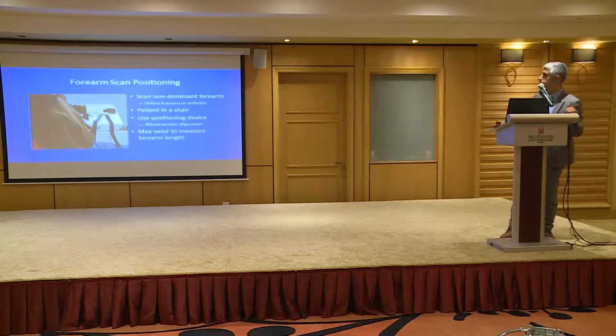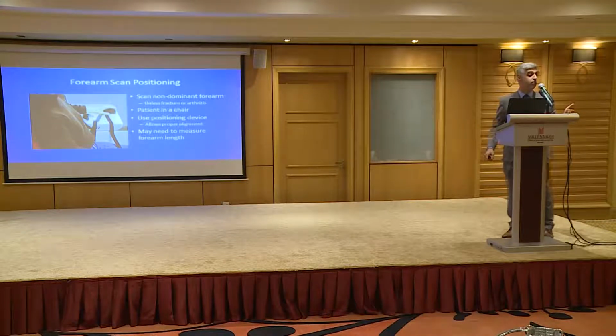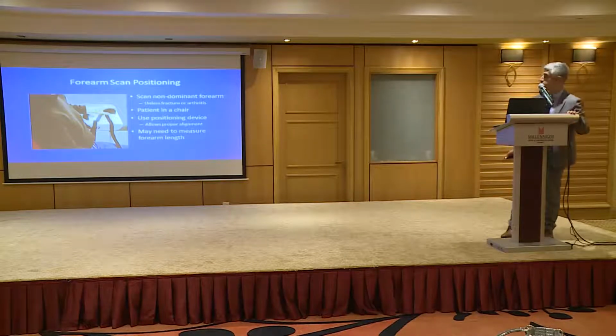The forearm positioning is much easier than the others because there are stabilizers for the forearm, and they just have to be straight. We like to use the non-dominant arm because it's less influenced by activities, weight, and exercise. Then you can see the true density of the bone.